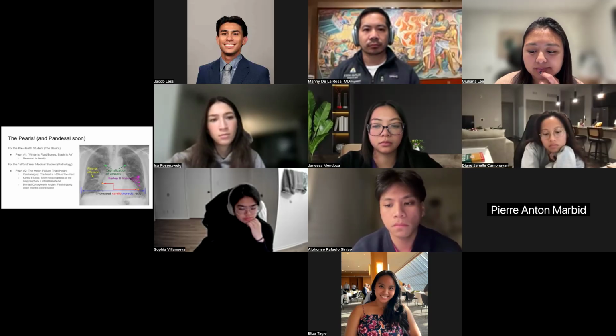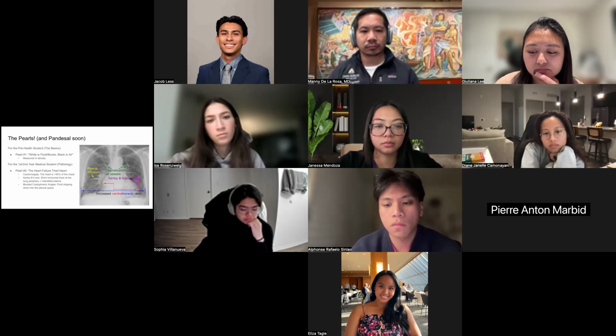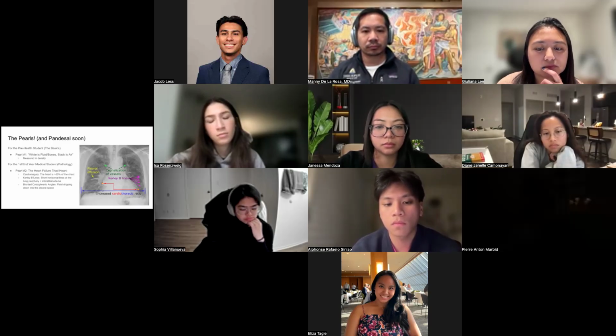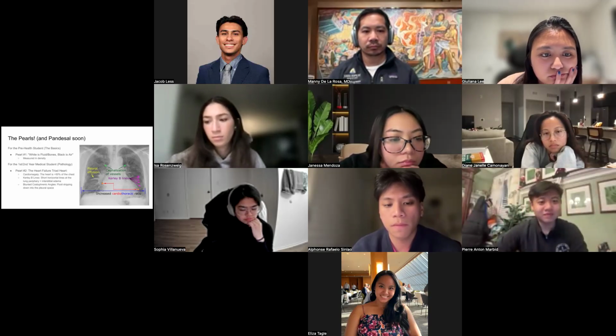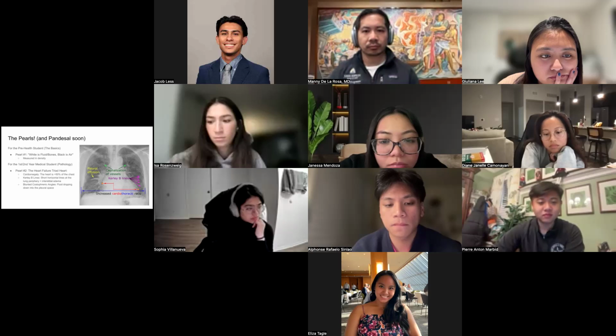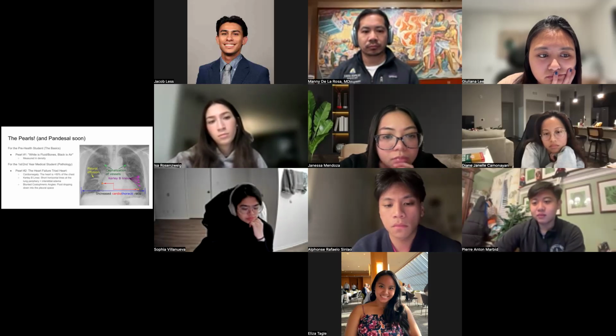For first and second year medical students, as you're starting to think about physiology and pathology, start to think of those slides that you're seeing in class and connect them to what the radiology images are showing. We've talked a lot about heart failure and different heart failure signs on chest x-ray. So one triad you can look at, and just to remember, the biggest one is cardiomegaly, right?